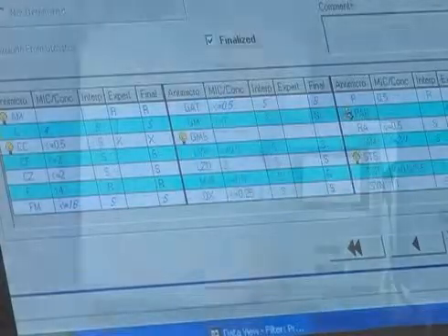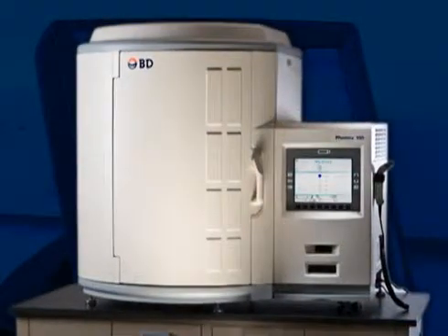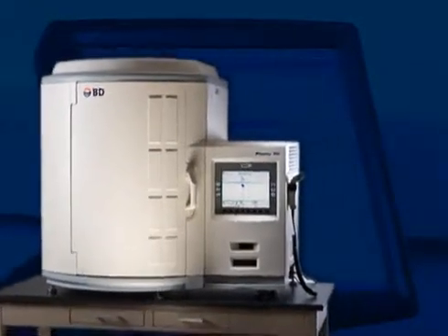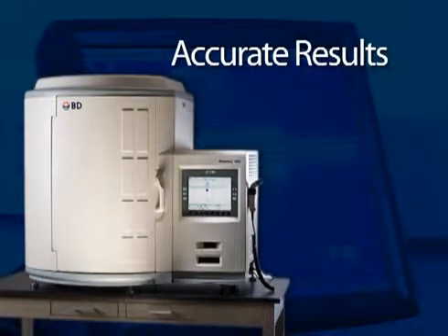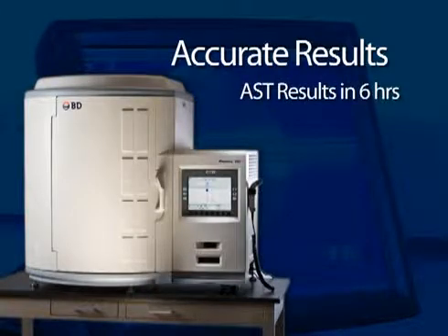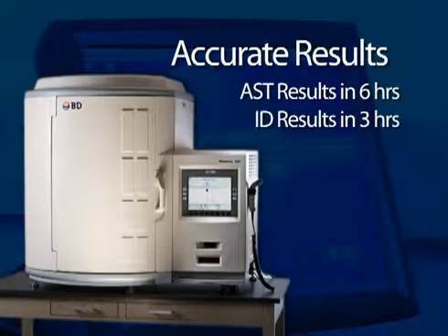BD Phoenix, like other Becton Dickinson systems, will provide accurate and reproducible results. AST results are generated in as little as six hours and identification in as little as three hours. Certain organism-drug combinations may take longer but can be reported as soon as available.